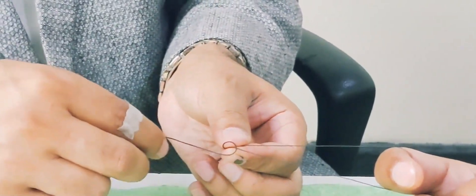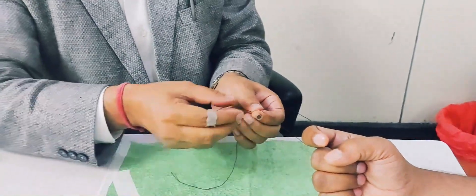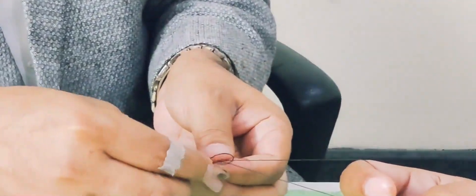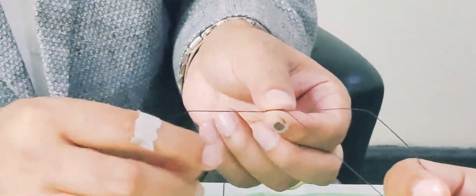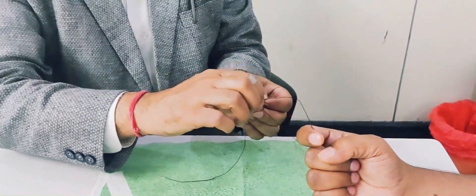There is no knot. Then number two comes the one full loop, full work. And then you are going to hold this like this. And then after this you will do a half knot. Half knot has to be done on the right arm, and you can see this. This is the half knot.